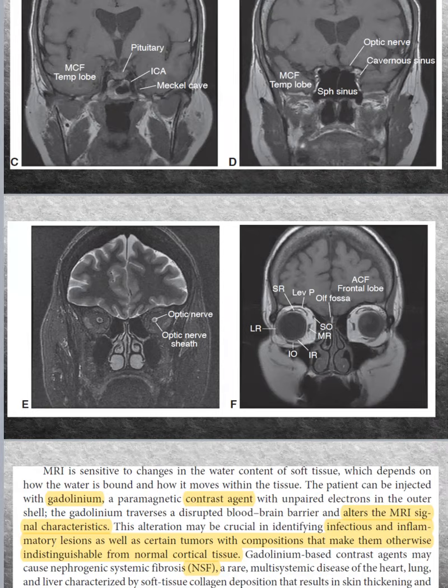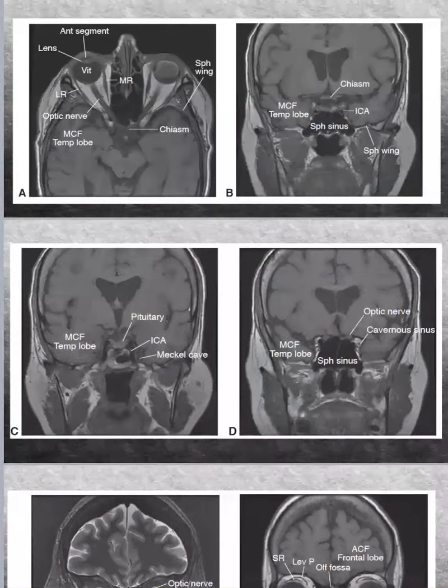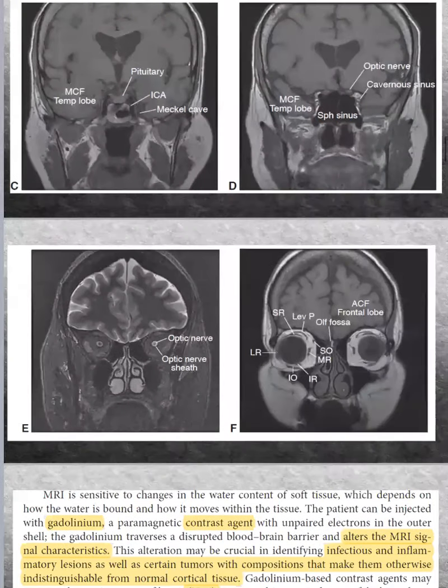For example, here I have this level like that, and I have below it this level. How did I know that this level is below this one? Because here I can see the pituitary, and here I can see the sphenoidal sinus in its place. So this is how I can have a clue for the level of the anteroposterior view.